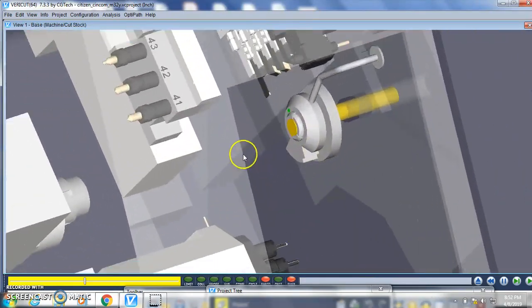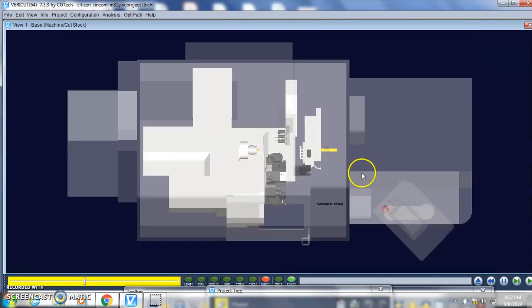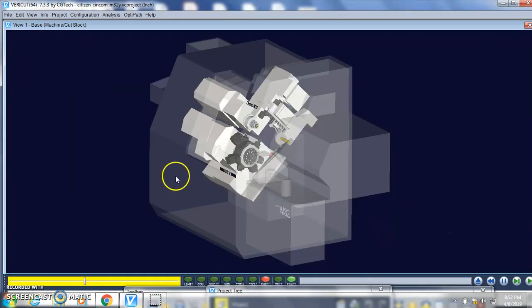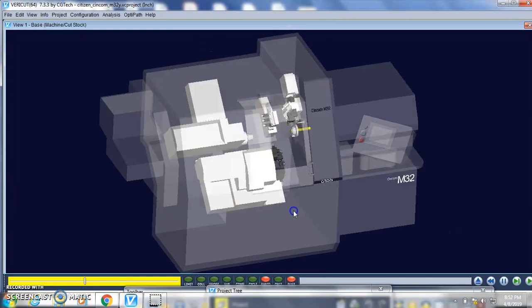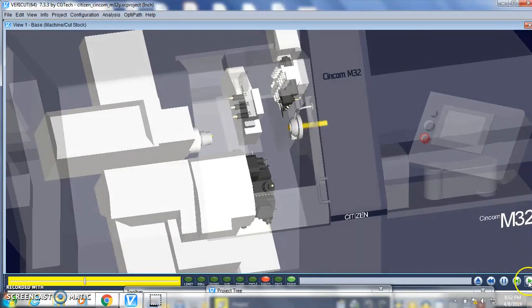So let's look at the simulation. If you want to change the view, you can select a different view type. You can select what type of view you're looking for. Right now I selected ISO. You can select this, or this, or use your mouse button to look at what you want. Let's start the simulation.